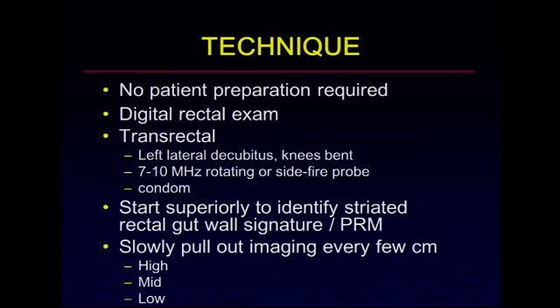It's sometimes helpful to have a lubricant that has a little bit of lidocaine within it in case it's a little bit painful. Now, no patient preparation is required for this exam, but I always precede the examination with a digital rectal exam in order to assess rectal tone. And I will ask the patient to squeeze around my finger so that I can determine if they can squeeze adequately circumferentially, or if, in the presence of the most common rectal tear that's located anteriorly, often you can feel that they can squeeze and clench the rectum posteriorly, but there is no movement or clenching palpable anteriorly.